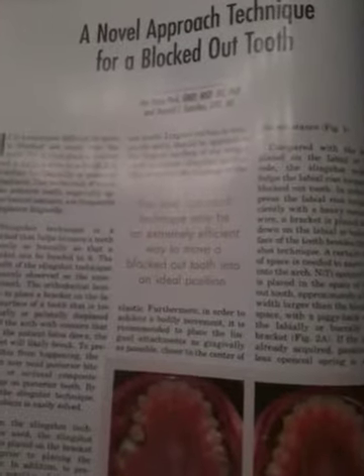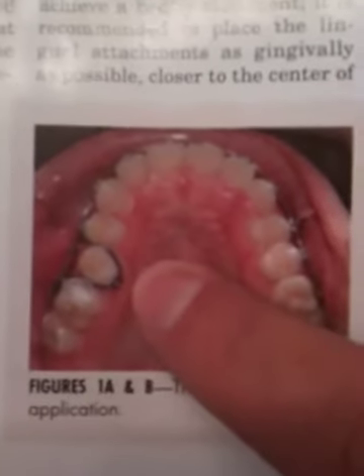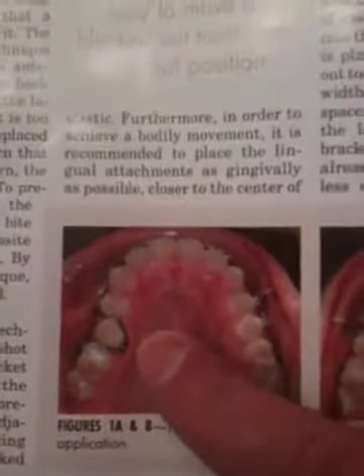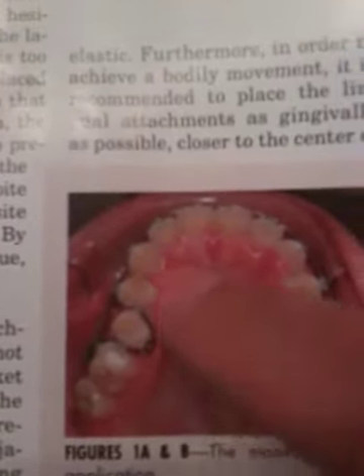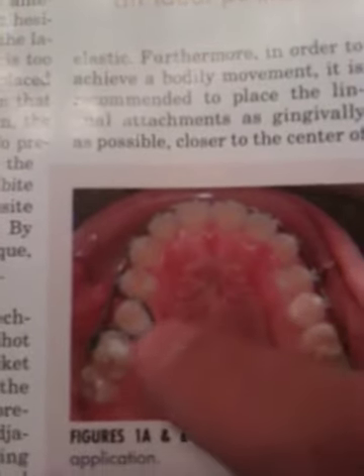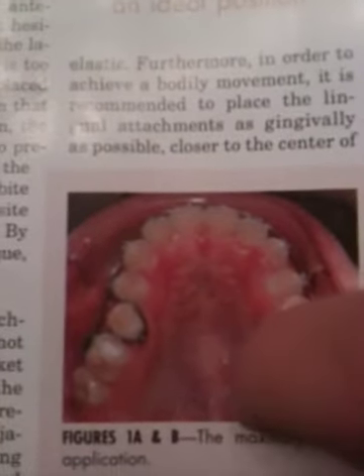Hi, it's Jar from 3monthbraces.com. Just talking about a way to squeeze in a tooth that is on the inside. This is describing what they call a slingshot technique, where you use a coil on the outside to open up the space, a little button on the lingual, and a power chain to pop the tooth out to the buccal.